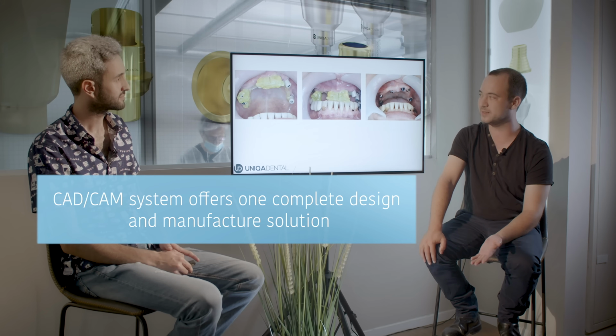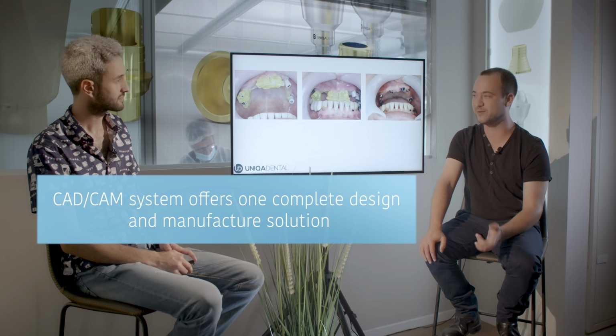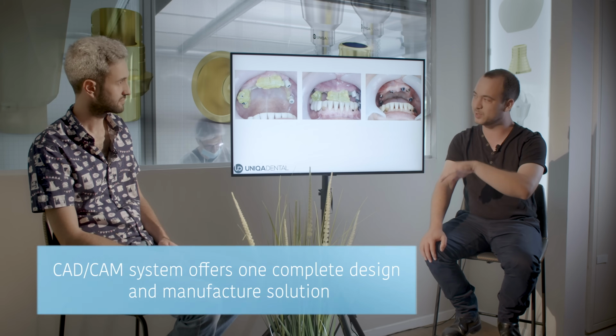And here the CAD-CAM has great benefits, because with CAD-CAM you can have different impressions. Because it's the upper jaw, you have all the palatal surface, so you can correlate different impressions using the palate. What would be quite difficult if you take traditional impressions. So here you can see different parts that were used.